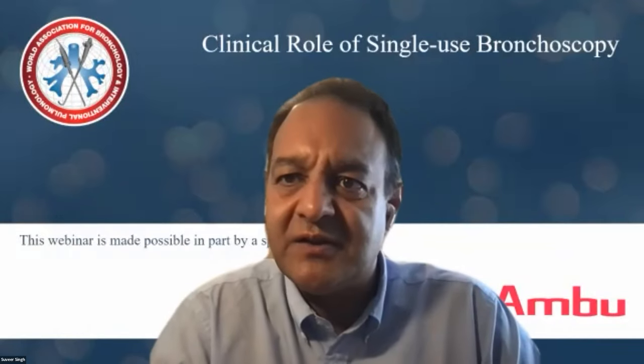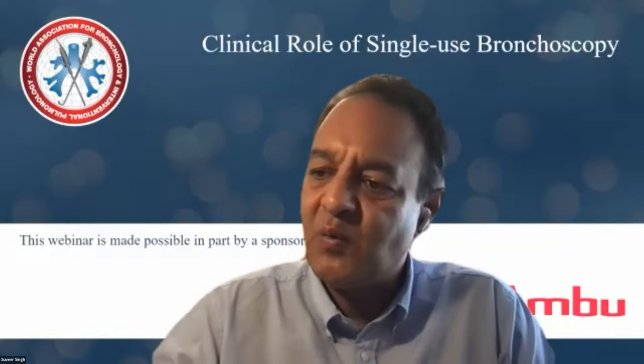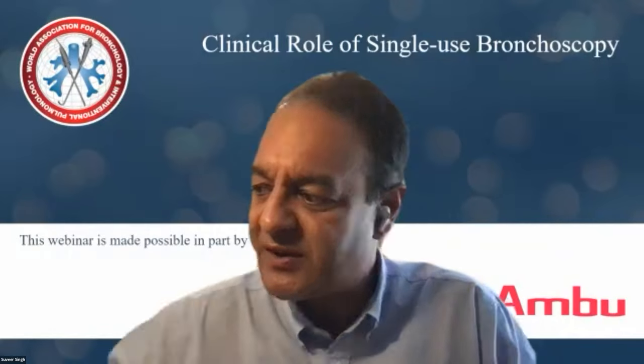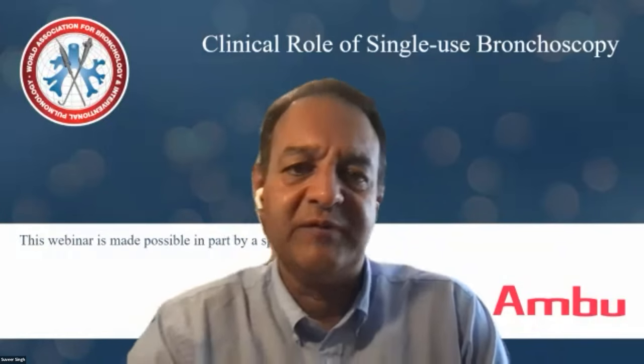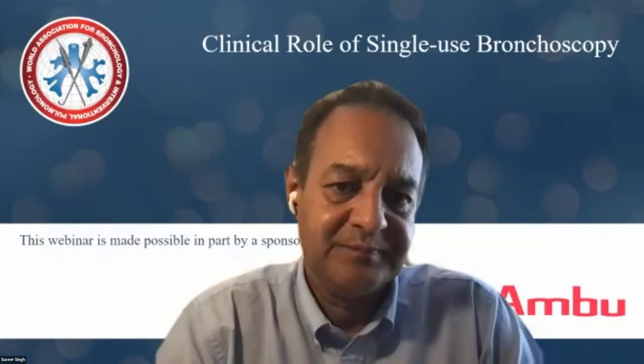If we just get back briefly to the technology, are we happy that the quality of the images, which was for so long the concern in single-use bronchoscopy, is at the level that we would be happy with in the interventional bronch suite? I think they're getting better and better from what we see. Every generation of a scope that comes out, the imaging just gets better and better. And I think we're at a point with some of these next generations where we can plug them into the current bronch suites that we have with all the screens and HDR screens, for those of us who have recently updated our suites or been lucky enough to, and actually give us that good quality imaging that we're used to. And so I just think we're going to be at a point where they're very equivalent.